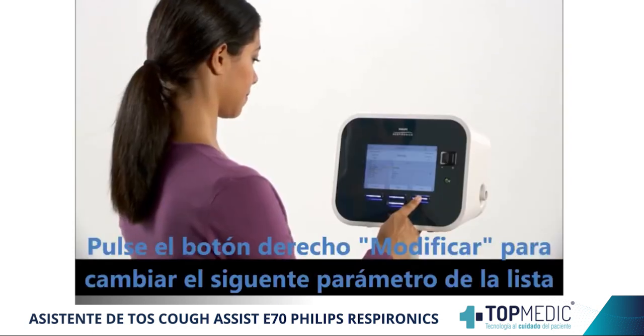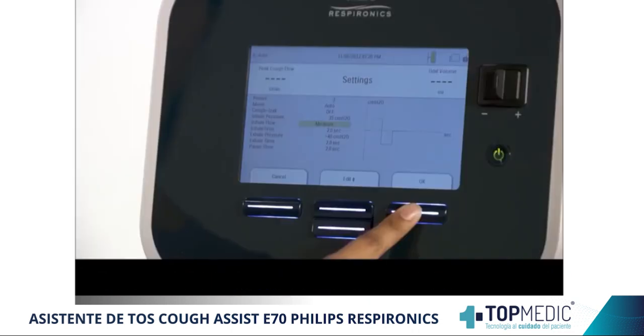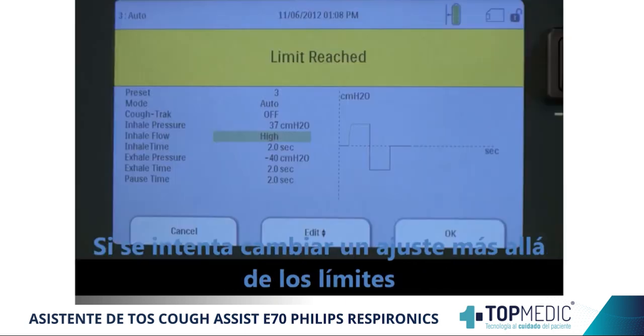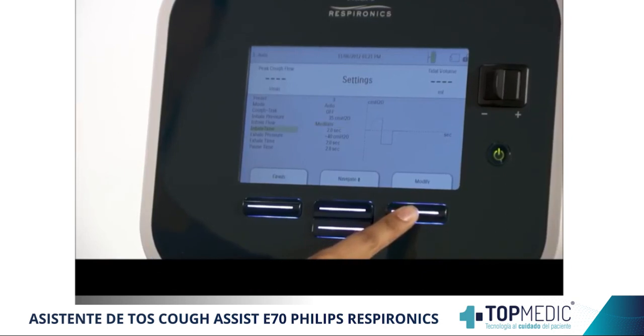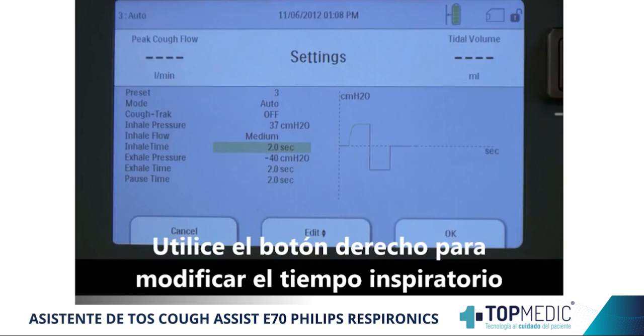Press the right button under Modify to change the next item on the list, which is Inhale Flow. Use the Up-Down Edit button to adjust. If you try to change a setting beyond the available parameters, a Limit Reached message appears. In this case, after you have entered the correct pressure, press OK to accept the new setting. Use the right button under Modify to highlight inhale time.